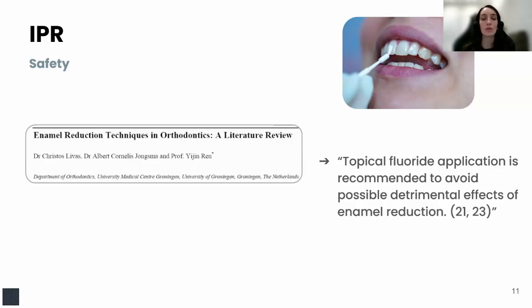Now, it's usually not something that you have to think about because, as I said, clear aligner companies already include them in your treatment plans. But it's important not to ignore them and actually perform the needed amount, just to make sure that teeth actually have enough space to carry on with the movements that they are planned to have.